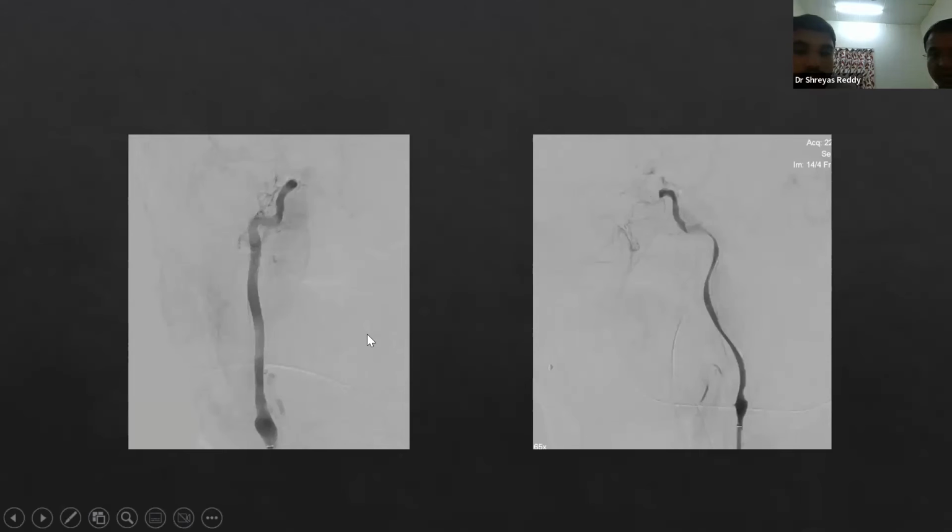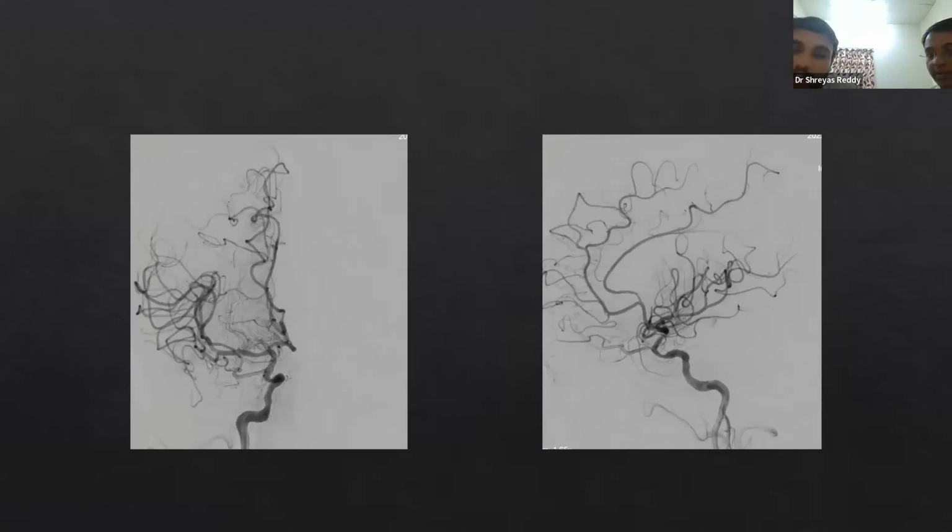What have we done for this patient? We have done a stroke thrombectomy, mechanical thrombectomy, for this patient. Can you see the irregular MCA over here? This is the ICA over here. So maybe the blood was coming and stopping over here in this cavernous segment, in the ophthalmic segment. So there possibly was a plaque over there, which was causing stenosis of the vessel and poor distal flow. Now that we have opened the vessel, you can see the antegrade flow.